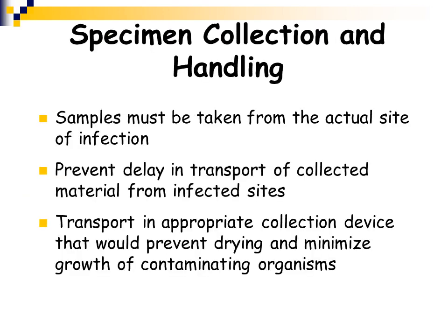Specimen collection and handling: when specimens are taken, they need to be taken from the actual site of infection. So if there is a deep wound, the specimen needs to be from deep into the tissue and not a surface skin specimen. There shouldn't be a lot of delay between collection and transportation to the clinical laboratory.